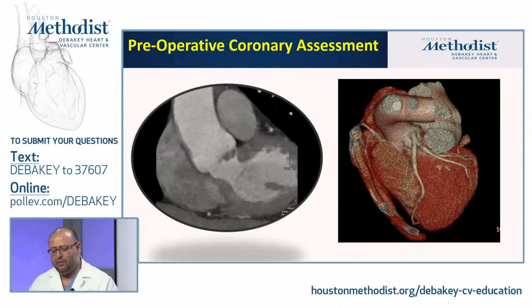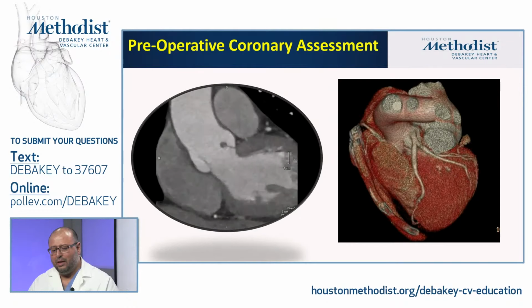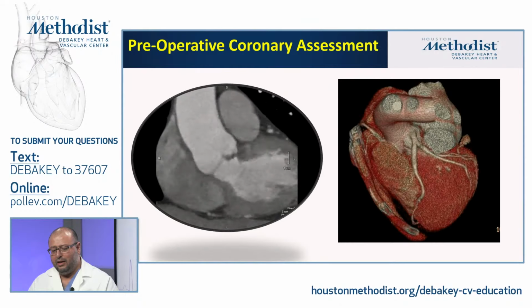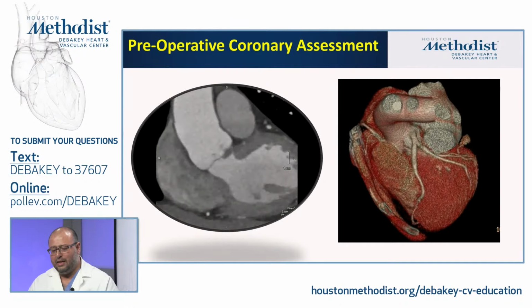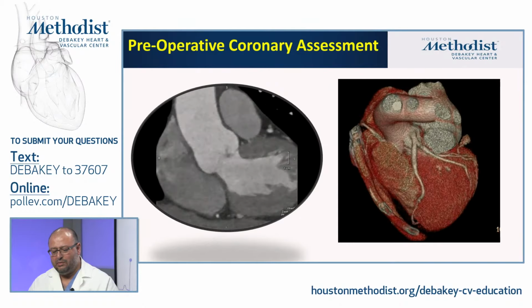to surgery. So, for example, this patient didn't come to CT for assessment of the vegetation, but you can imagine everybody would be very concerned about engaging the coronaries when you have this vegetation on the leaflet, and we were asked to do coronary assessment for these patients, and this is where we potentially see these vegetations.